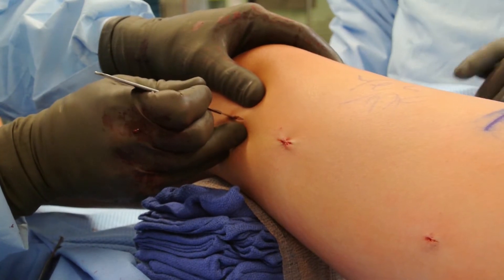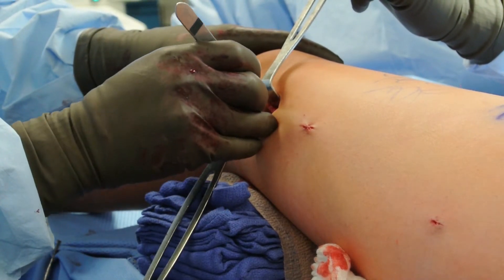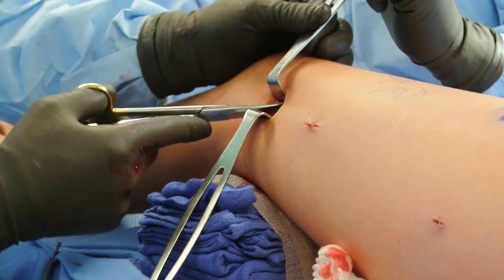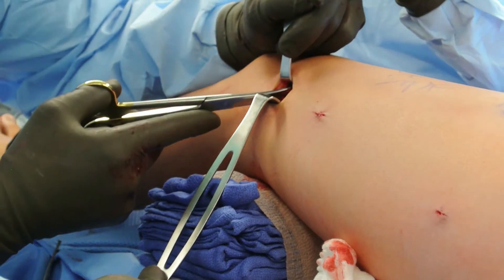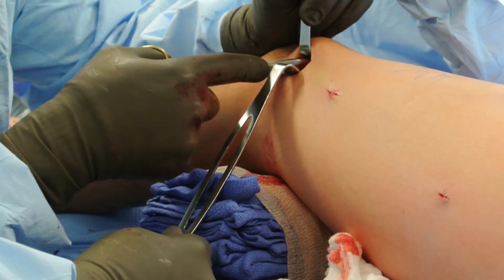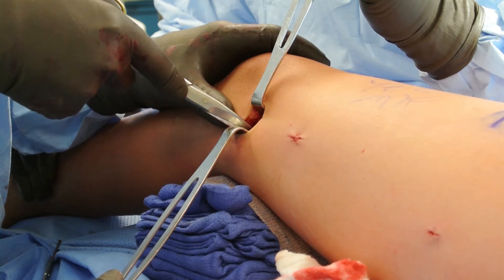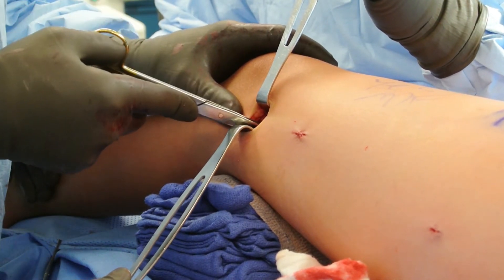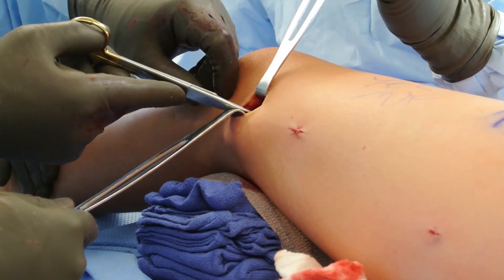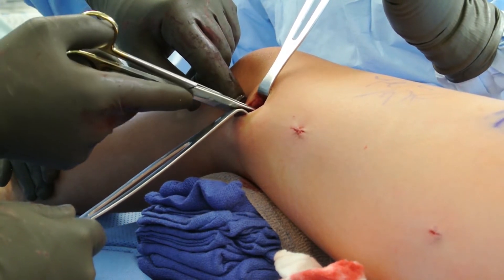Iliotibial band release is performed in the majority of congenital leg length discrepancy cases, as well as any cases that have knee instability and/or iliotibial band tightness. In cases of stature lengthening and post-traumatic lengthenings of less than five centimeters, it can sometimes be avoided. This transverse release of the fascia lata and intermuscular septum is usually done through a mid-lateral incision just proximal to the level of the superior pole of the patella. If done more proximally, then an unsightly muscle herniation can occur.